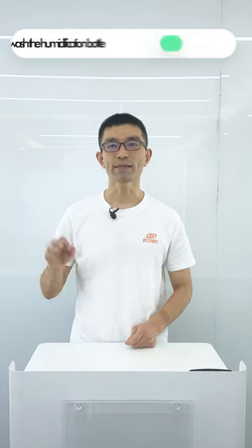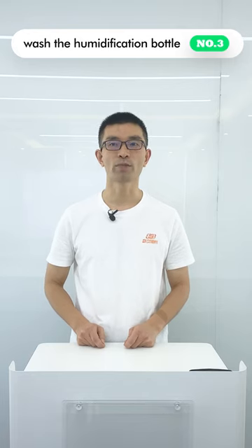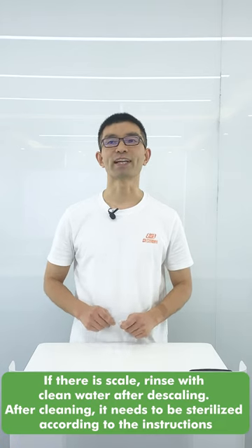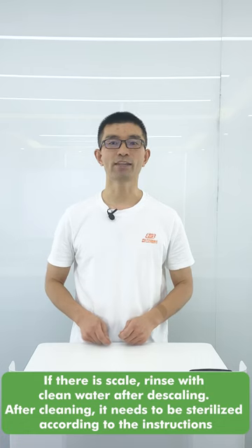Tip 3: It is also important to wash the humidifier bottle of the oxygen generator with warm water. If there is scale, rinse with clean water after descaling. After cleaning, it needs to be sterilized according to the instructions.